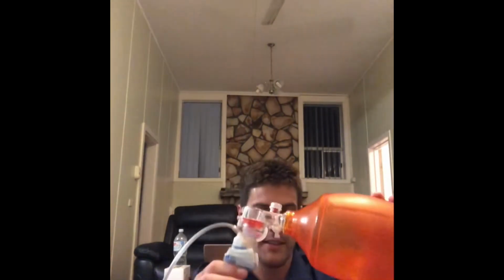Right, so we're going to make sure there's a filter between the face mask and the end-tidal CO2 detector just to stop it from gunking up. Then that'll be plugged into the breathing circuit. We've got to make sure this is all connected before we start an RSI. We've got to make sure that the end-tidal CO2 tube isn't kinked, bent or twisted, and that we're not going to trip over it and dislodge it.